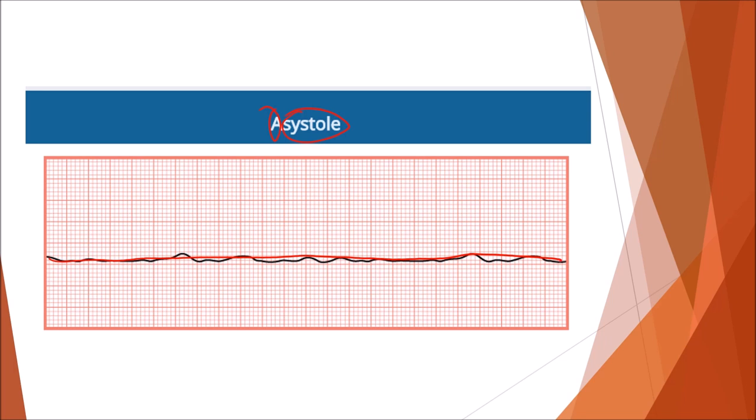So this is when you hear that machine go beep, right? This is not a shockable rhythm. Despite what you see in the movies, you do not shock asystole. You cannot get something that's dead back to life. So asystole is a non-shockable rhythm.